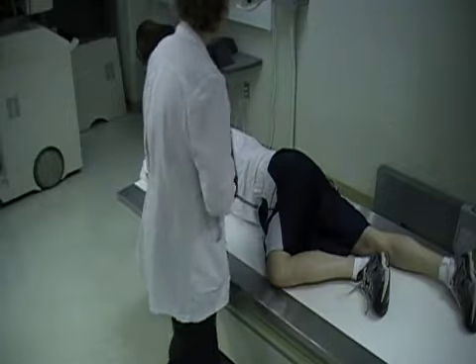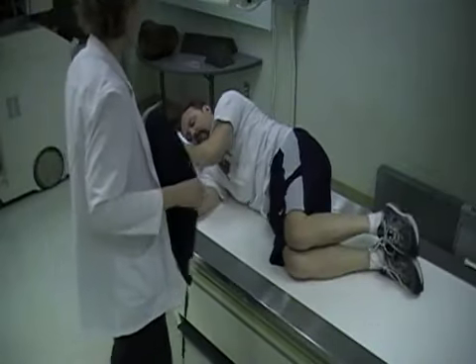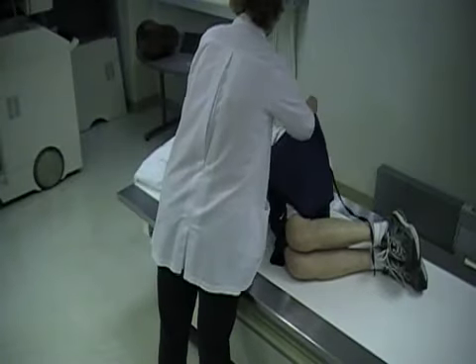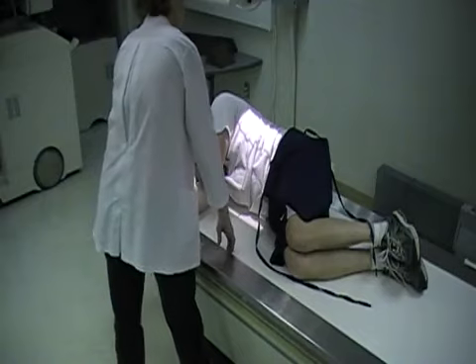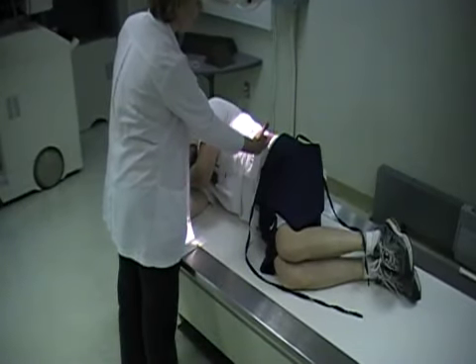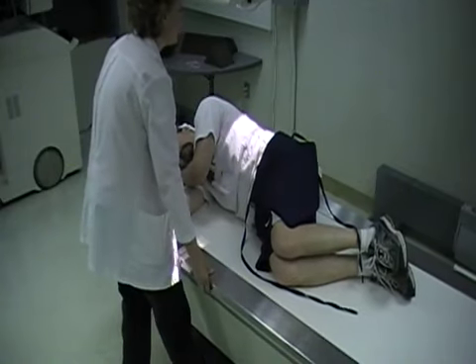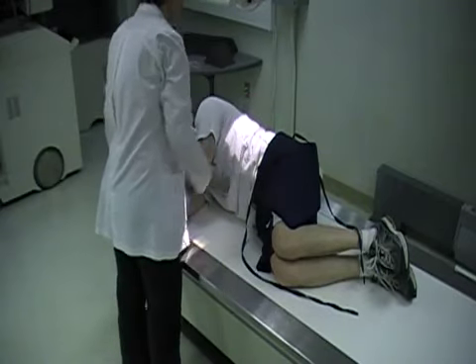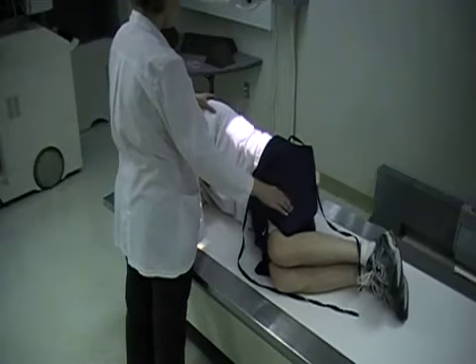Okay, now for the right lateral of the stomach. Have the patient on their side. You're going to palpate the bottom border of the ribs. Your transverse line will be 1 inch to 2 inches above that. Okay, find the mid-coronal. Scoot towards me just a little bit.